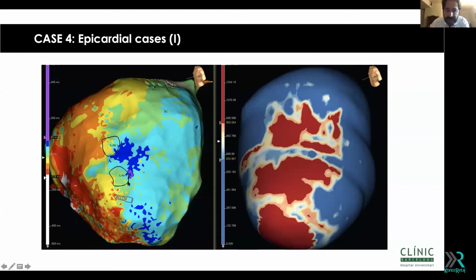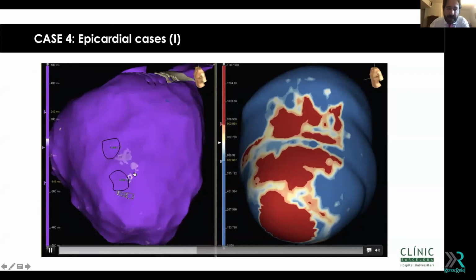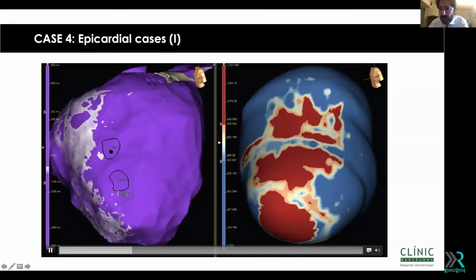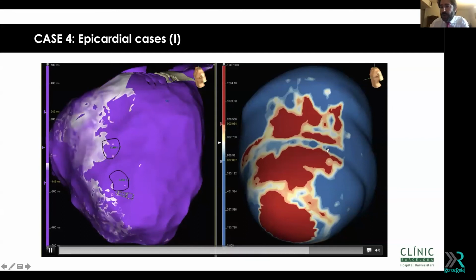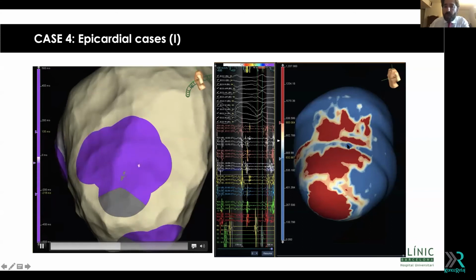And if you see this area, these are exactly the areas of the MRI channels. If you see the activation in sinus rhythm in these areas, you can clearly see that there is slow conduction during sinus rhythm, so no need for VT in these areas. And you feel comfortable because you see this slow activation in an area where the MRI showed you that there are channels. More, we could map fast VT here with diastolic potentials, and this area was the area that the MRI suggested.